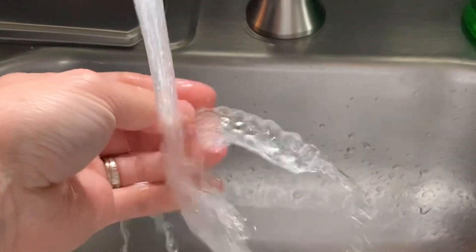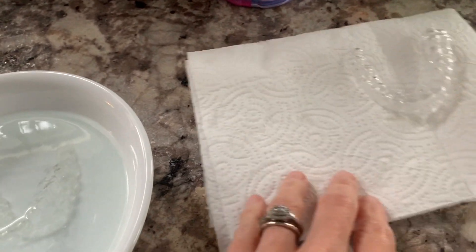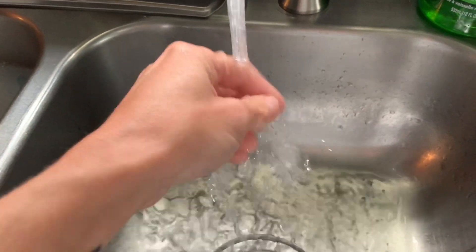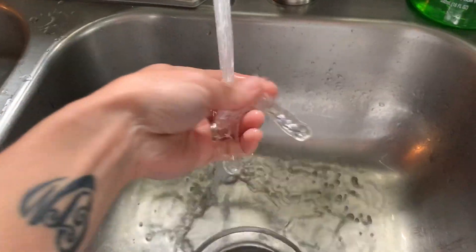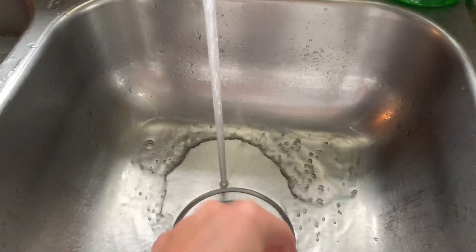After about 20 to 30 minutes your retainers should be ready to remove from the solution. Make sure you have cool water running so you can rinse the solution off thoroughly — you don't want to leave any residue behind. I like to use a paper towel to take my retainers out of the water after rinsing so they can fully dry before I clean them with the next product.